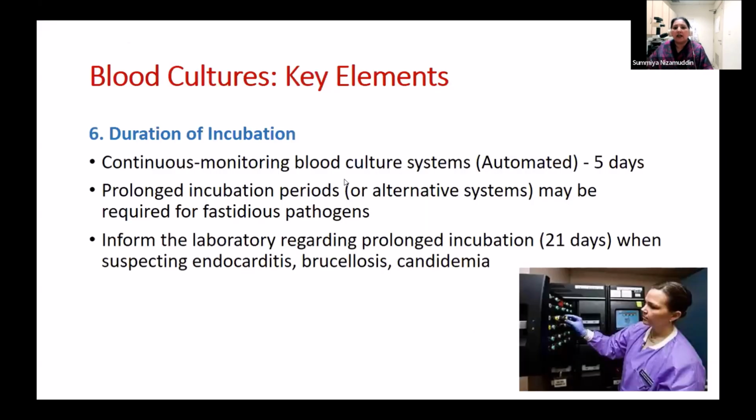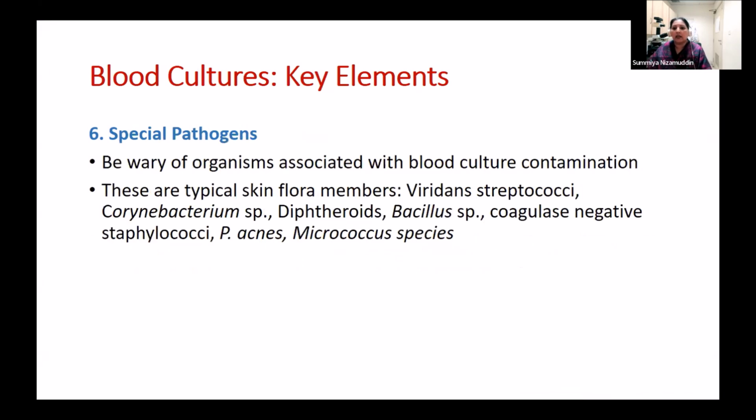Duration of incubation. So हमारे पास जो automated blood culture systems हैं, we hold the bottles for 5 days. This is in accordance to international guidelines. Guidelines यही कहती हैं कि at least 5 days तक आपने blood culture की bottles को hold करके रखना है. But there are certain conditions where you can actually request the lab to hold the bottles for longer. So for example, if you're suspecting endocarditis or brucellosis or candidemia, you can call the lab and let them know कि please मैं ये suspect कर रहा हूँ, and could you hold the bottle for longer. So in those cases, we hold the bottles for at least 3 weeks or 21 days. And we do that especially for endocarditis, for brucellosis, and for candidemia.